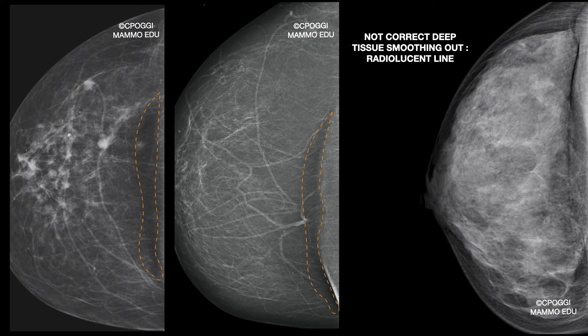We talked about pseudo-artifacts in the first lesson. In this case it is not a pseudo-artifact — it is a real one, due to not effective smoothing action in the IMF. Very interesting is this last example: you can see a thick, radiolucent line. It is air trapped in this portion, which, even if not clearly visible, extends through almost the entire breast.